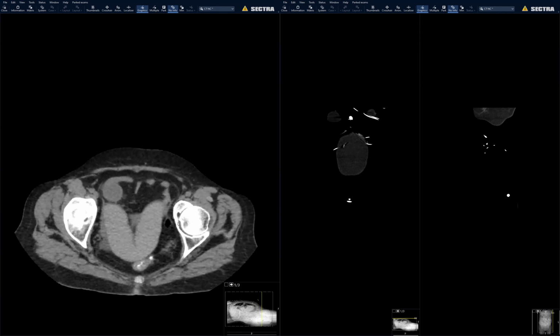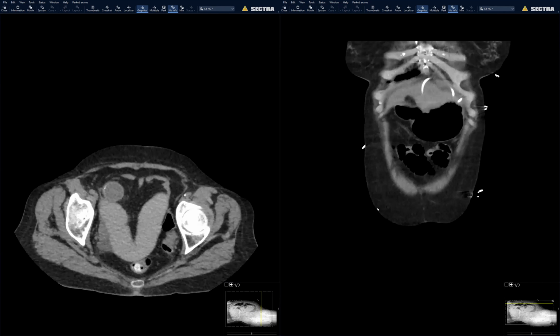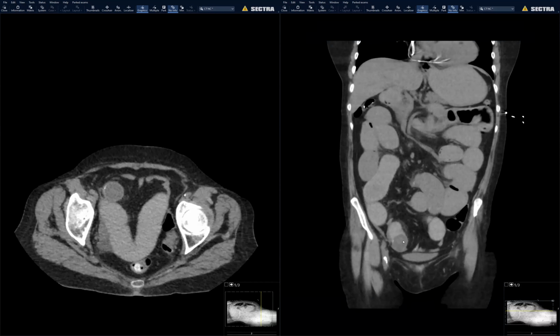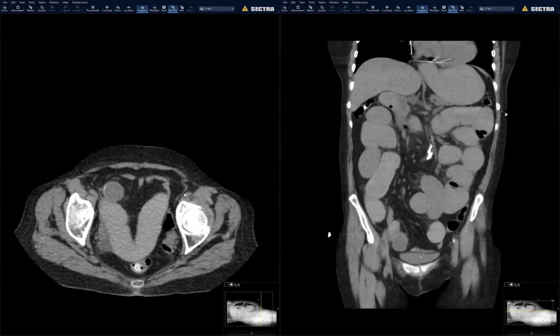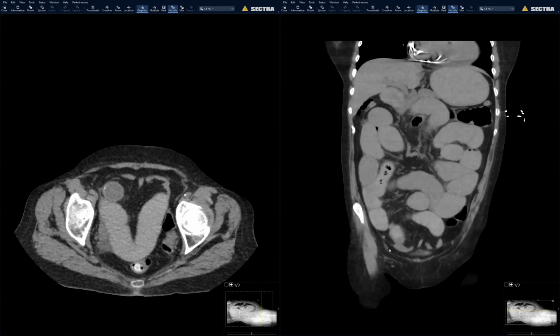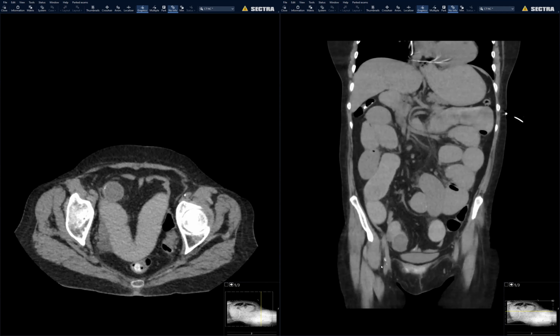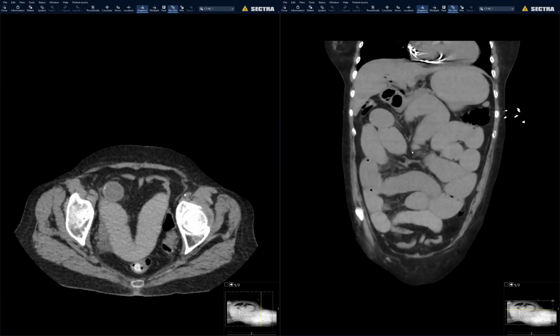Yeah, I think Anu got it. Whoever answered gallstone got the right answer. It's right there. So the surgeons refused to believe the residents on call that night, so they called an attending and then they had to take the patient to the OR. It did turn out to be a laminated stone. It's a great case of gallstone ileus, I think.